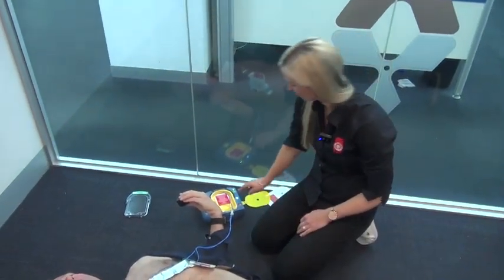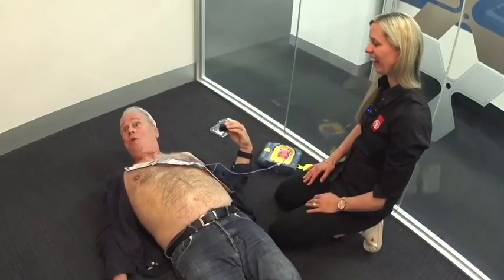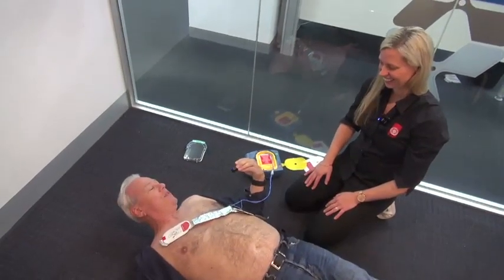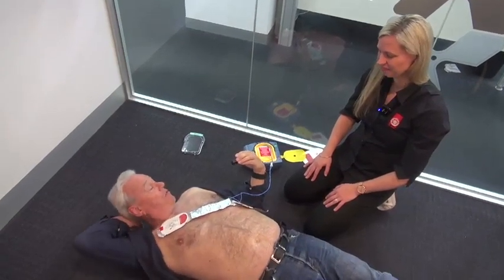I'll turn that off — I feel so much better, you brought me back to life, thank you! It's a miracle, folks. Katie, this is extraordinary and it seems so incredibly simple when you do follow the instructions.